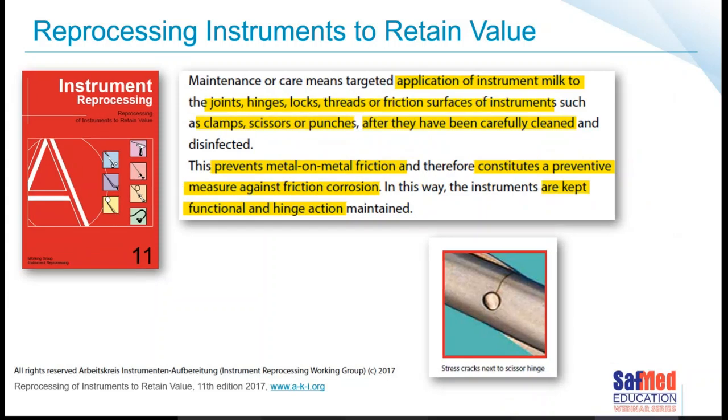Same applies if you're trying to use them in the operating room and they were so damn hot and you've now got them in the operating room. It's problematic. Remember, we need enough instrumentation that everything can cool down well.